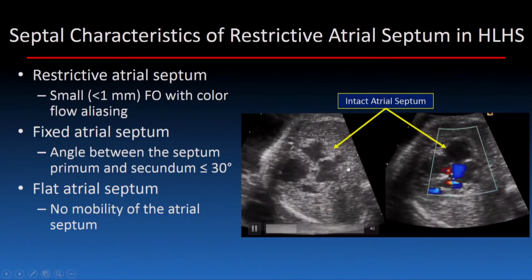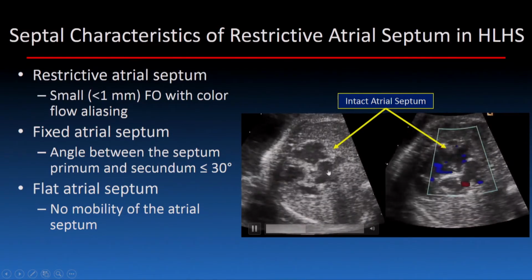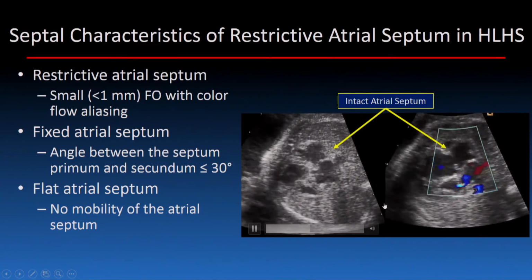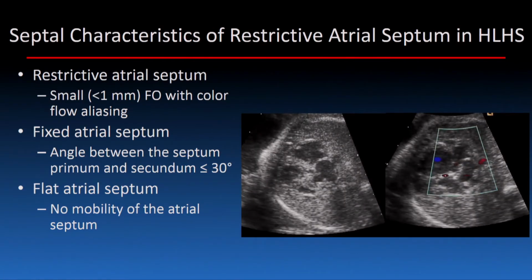atrial septum at all. And this is just an example of a patient with hypoplastic left heart syndrome with an intact atrial septum with no flow across there by color.